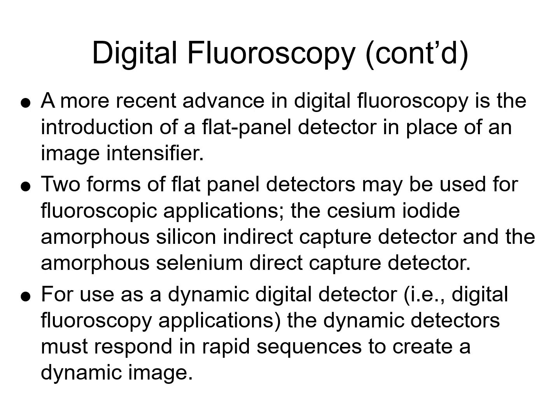And so you're going to learn again about the active matrix flat panel array, which is that second bullet point, the flat panel detectors. You're going to learn about those in digital imaging. There are two types, indirect and direct.